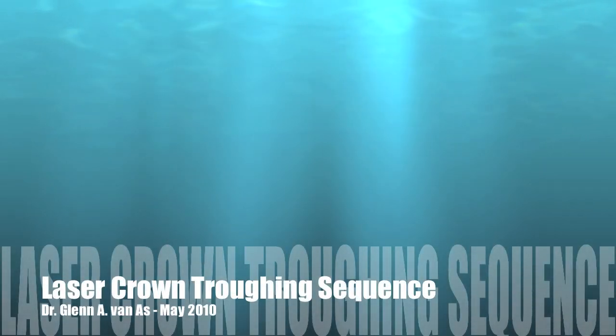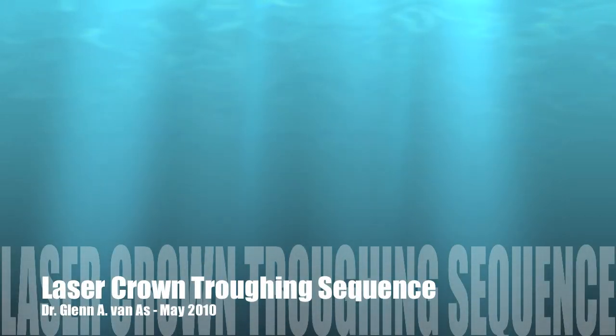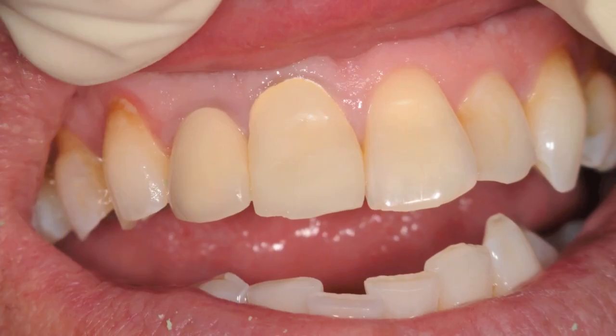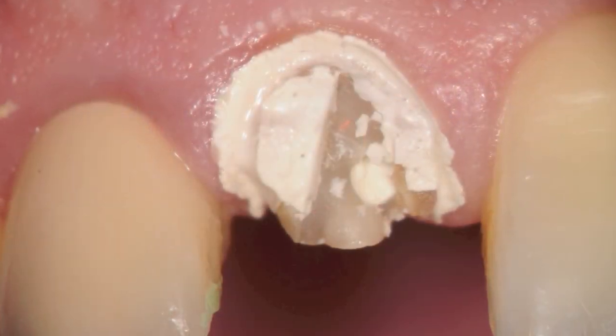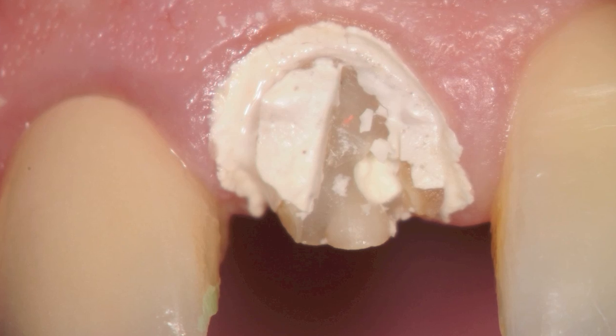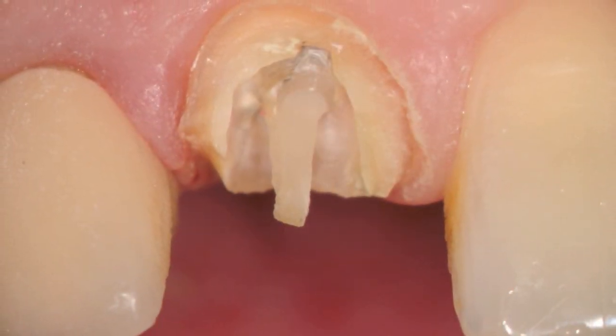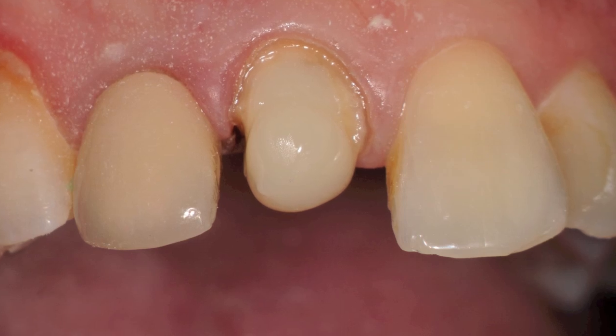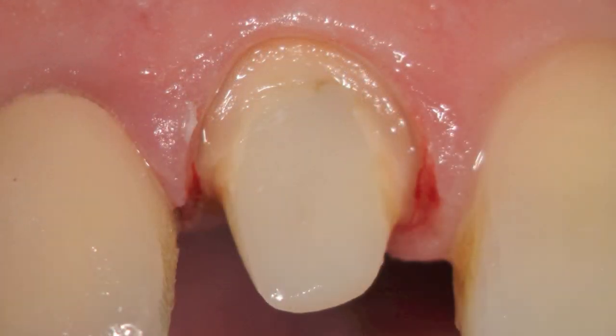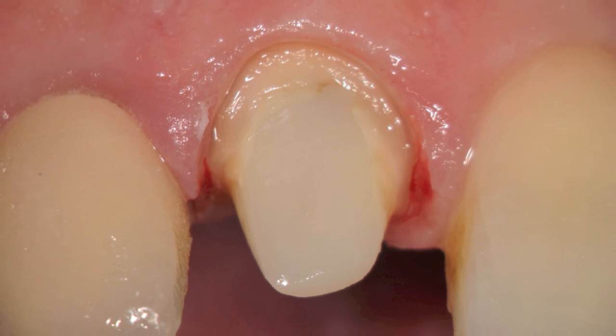In this video, we're going to see the sequencing involved in laser crown troughing. You can see an upper right central that has a provisional here in place, which had fractured off. After discussion of treatment options, the patient decided to try and save it one more time. The post was uncovered a little bit and core material was added. At this point, we roughed out the prep and are ready to proceed with laser crown troughing.